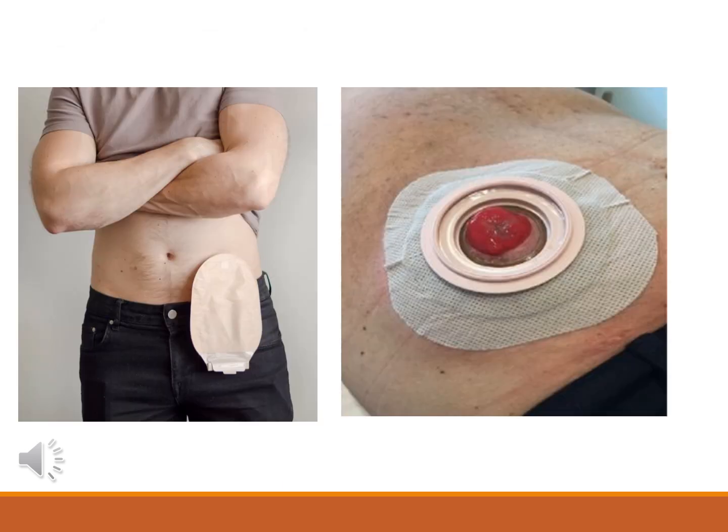These images represent what a patient with an ostomy bag will look like. So the ostomy bag will cover the area of the stoma. The stoma is the image on the right. So that's pretty much just showing where the surgical area is, and then the bag connects to that stoma, and then the fecal matter is collected into the bag.